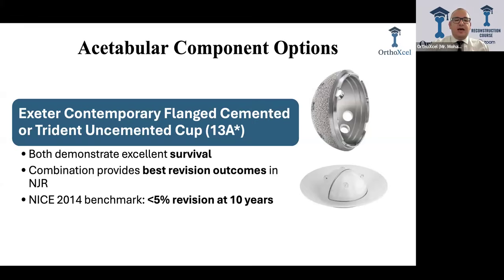So 13A plus has now become 15A plus because this component has been on the market for the last 15 years, and I will take you through the ODEP rating in a minute, explaining what 13A plus or 13A star means. So 13A star means this component has been on the market for 13 years with a very low revision rate, and this is evidenced by good or high quality evidence.